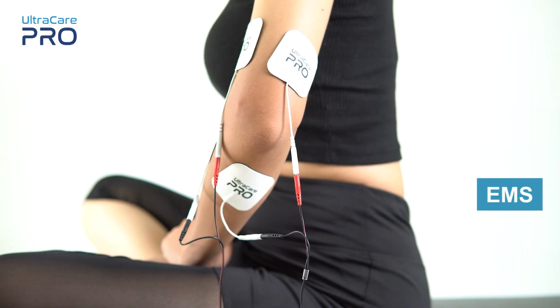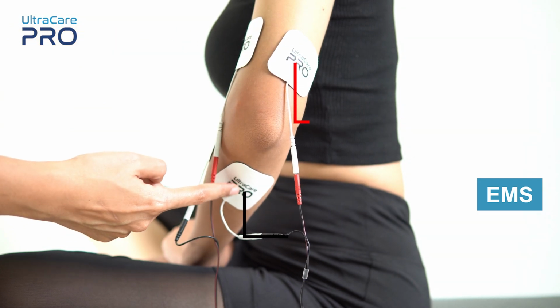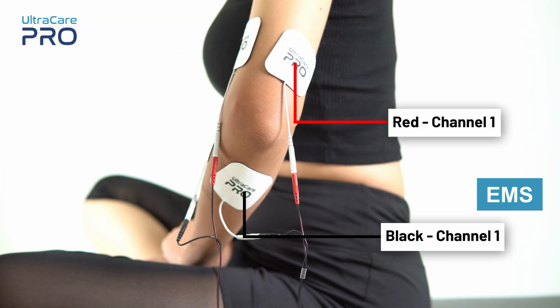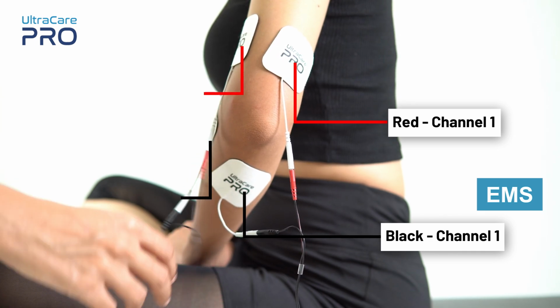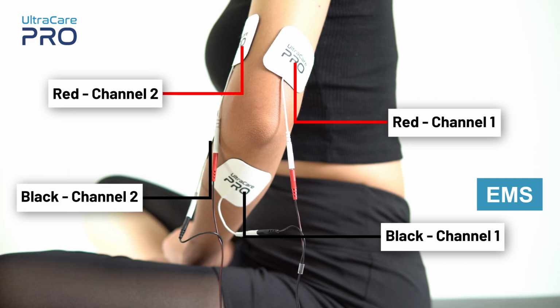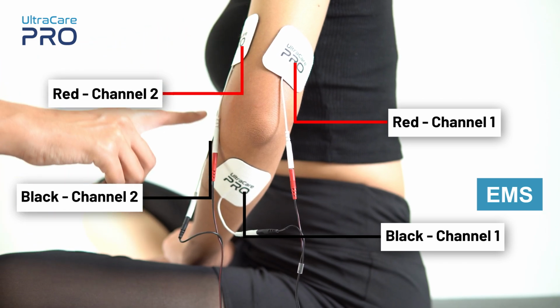For EMS application, place red and black electrode from channel 1 on one side of the elbow region, whereas place red and black electrode from channel 2 on other side of the elbow region over the muscle that needs to be stimulated.